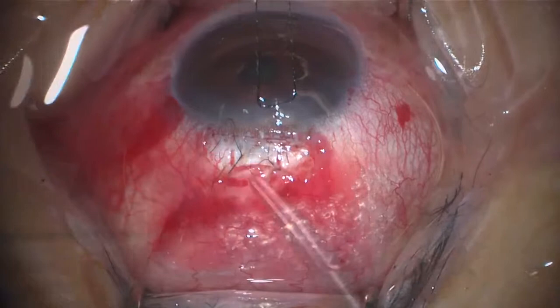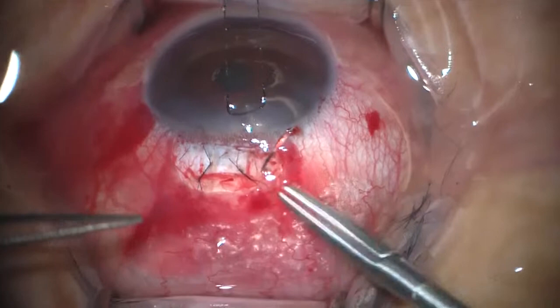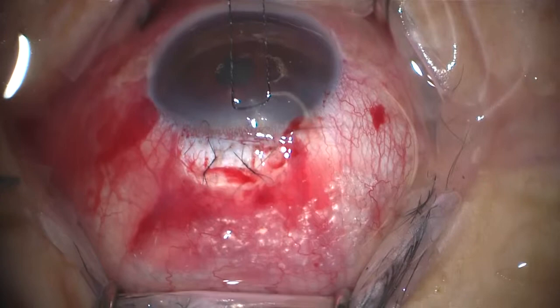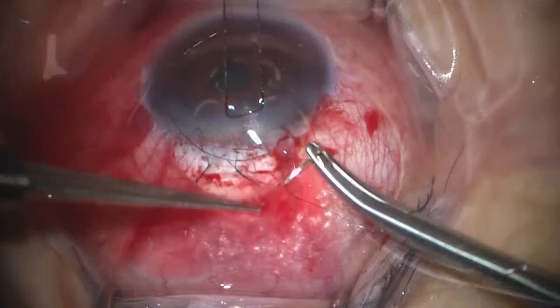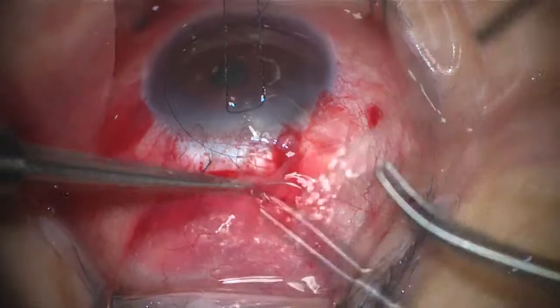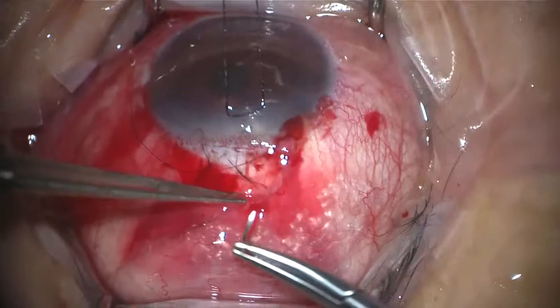Good. So we'll do the purse-string suture. So scleral bite. And then we'll do our purse-string. So we're on the inside of the conjunctiva, so we come inside to out. Then we're on the outside of the conjunctiva, so outside to in, inside to out. And you can see I'm just doing this just at the edge of the conjunctiva. And then the final one is outside to in, so the knot's on the inside.